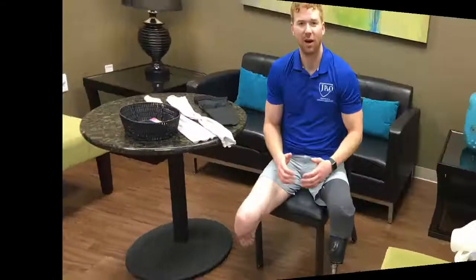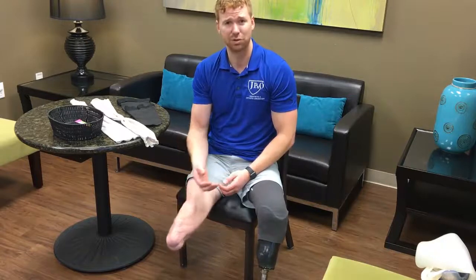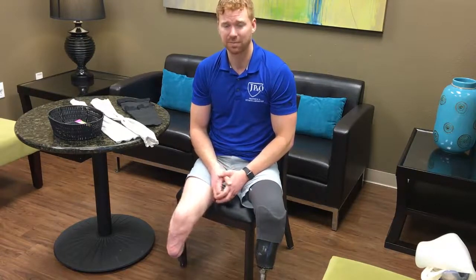Now, I want to show you how to actually put on a shrinker sock properly. A brief tip before we start: if you're a new amputee and your residual limb is very sensitive, it might be a good idea to use a donning tube to put the shrinker sock on. Sometimes the stitches or the suture line may be very sensitive, and this may be beneficial. And again, always be mindful of those things when putting on a shrinker sock.